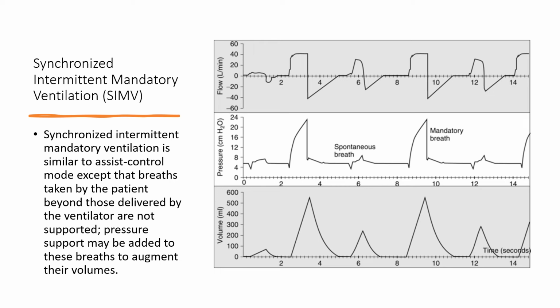So now let's talk about SIMV. SIMV is a hybrid mode. Basically what happens is you set a respiratory rate that is kind of low, you set a tidal volume, but the patient can spontaneously breathe in between. And let me show you what I mean.